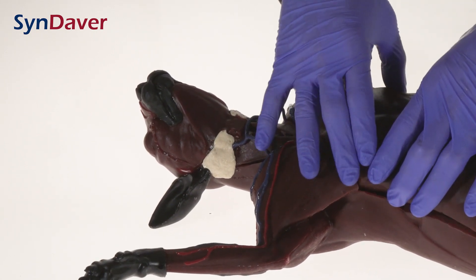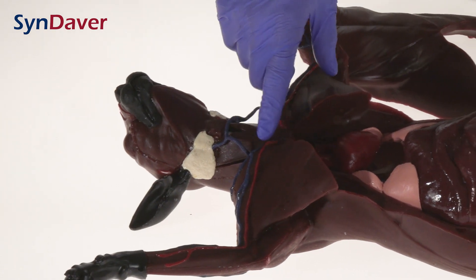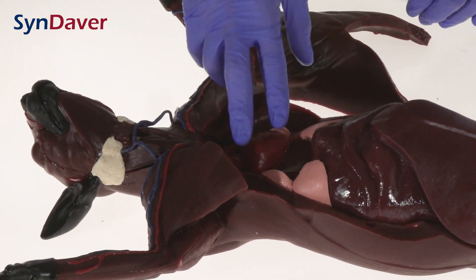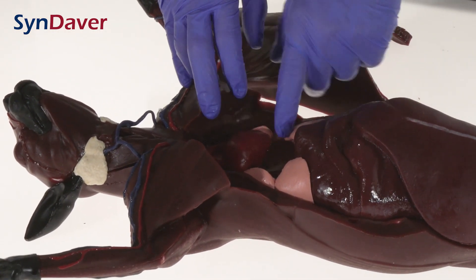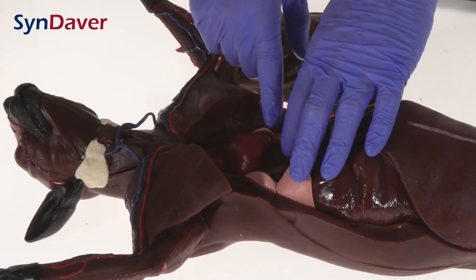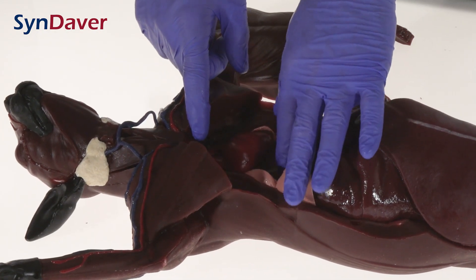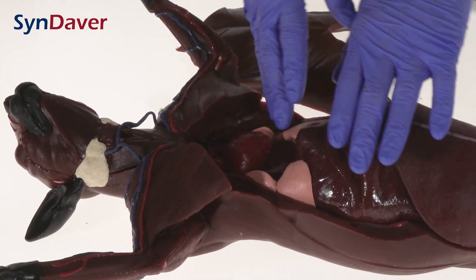The chest plate removes, identifying continuation to the heart of the vasculature as well as the esophagus, the trachea bifurcating to the lungs, and also the heart where we have the descending aorta, caudal vena cava, and all the vasculature moving to the diaphragm.